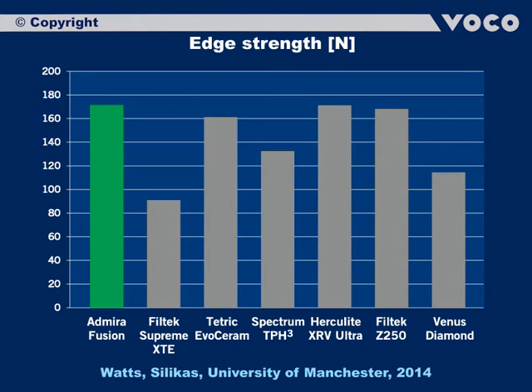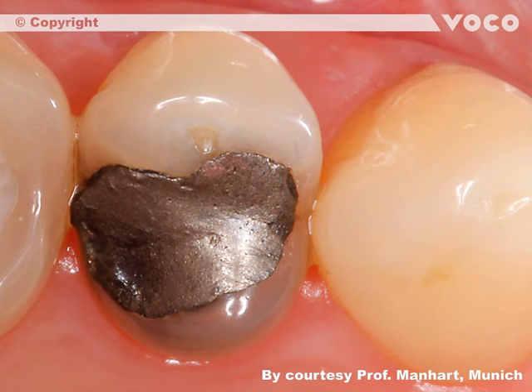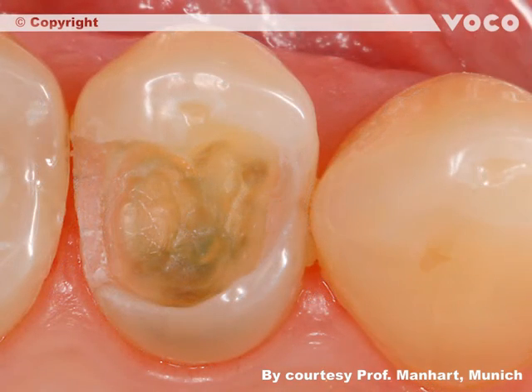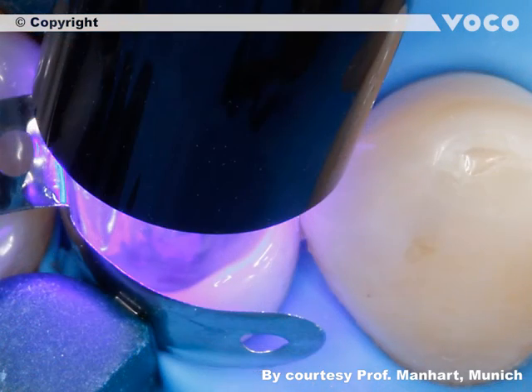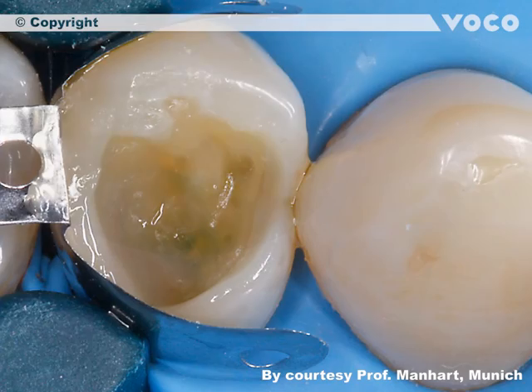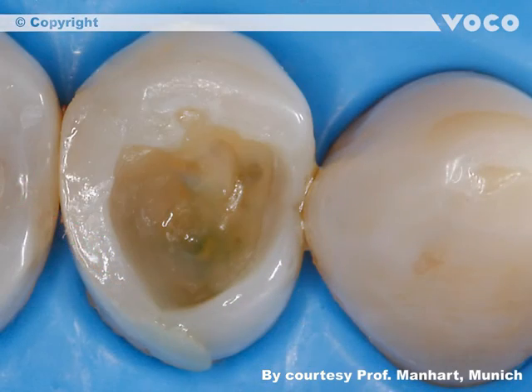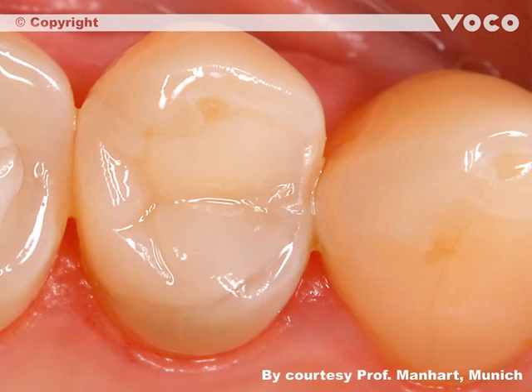Especially in the posterior region it is important to create stable fillings which resist high chewing forces permanently. Finally, we present a clinical case. The initial situation is an insufficient amalgam filling — a class II restoration at tooth 1-4. Firstly, the amalgam filling is removed completely, followed by drying the operating area and application of the matrix. Further steps are application of the adhesive, dispersing the excess solvents and light polymerization. The application of Admira Fusion starts with building a distal wall, which is then light cured. The matrix is removed and the additional increments are applied and also light cured. The last picture shows the finished and polished restoration — function and aesthetics are restored completely.